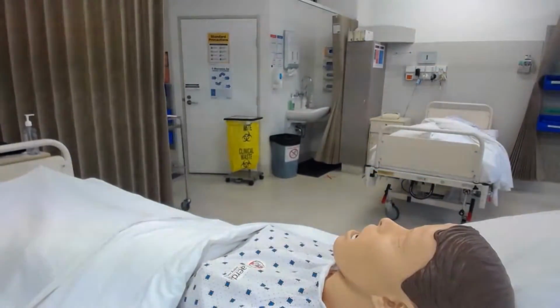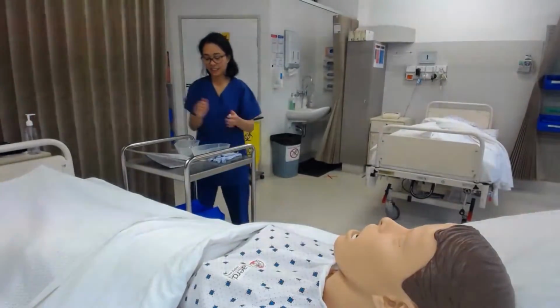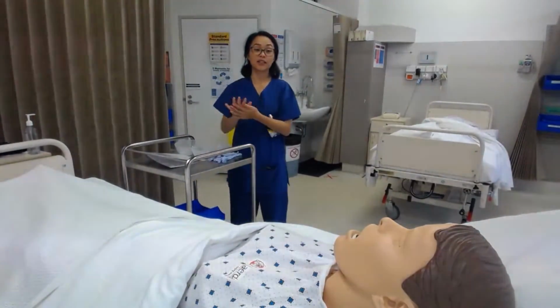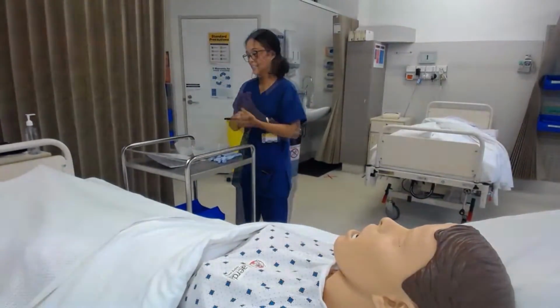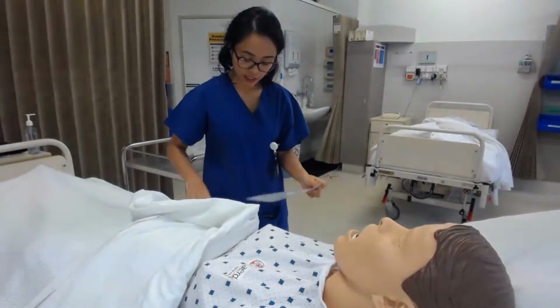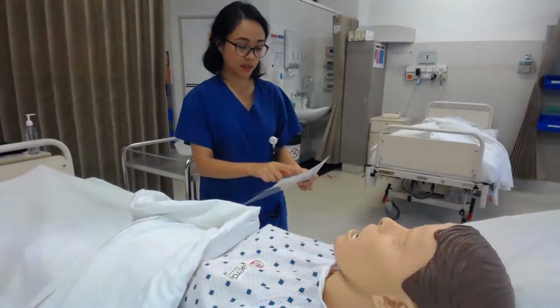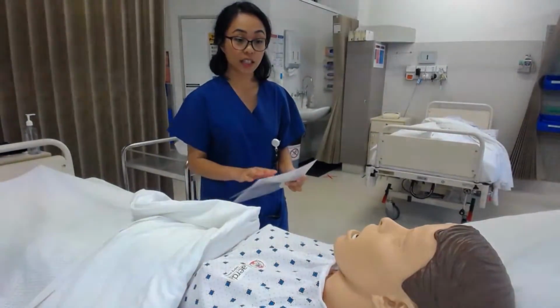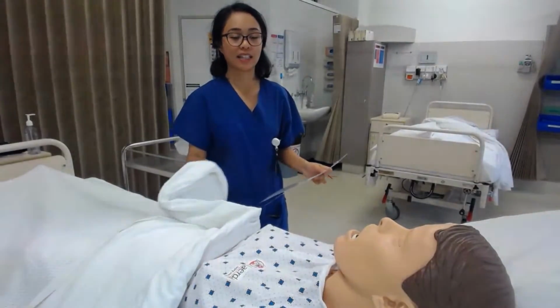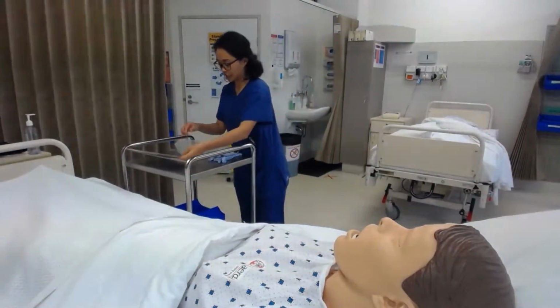Upon entering the patient's bed space, remember to perform hand hygiene. You can now perform the third check of the medications. This third check must be performed at the patient bedside, and a patient identity check must be performed at this point. Full name, date of birth, medical record number, comparing the patient's verbal response, the medication chart, and the patient's armband.